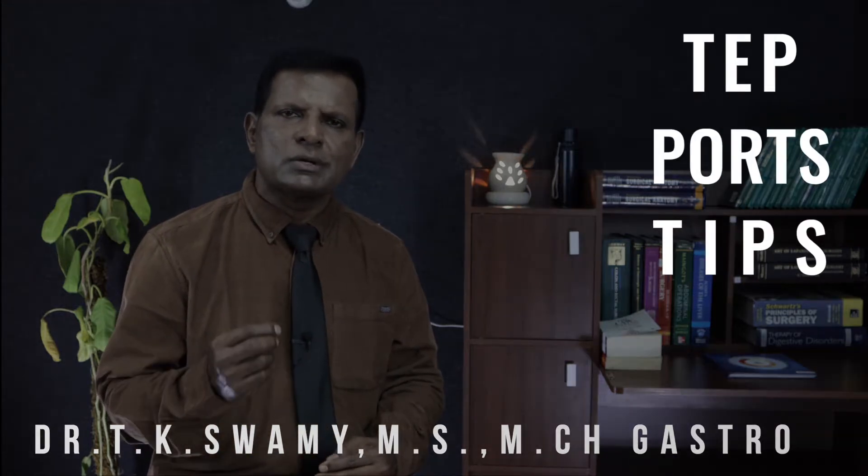Hello, I'm Dr. T.K. Swamy, surgical gastroenterologist. In this video, I will show you how to put the ports for TEP repair — totally extraperitoneal repair of hernia.